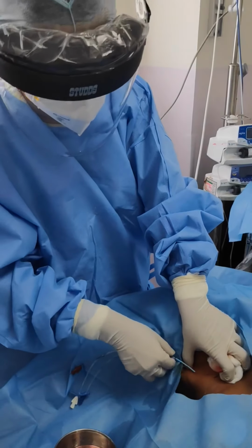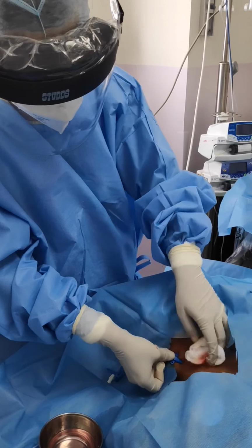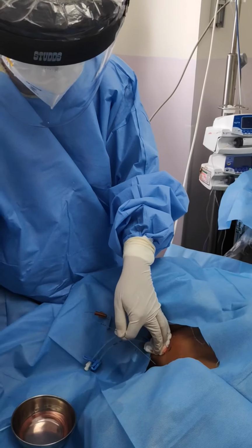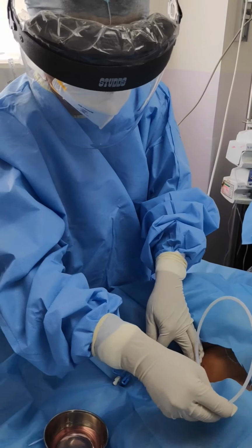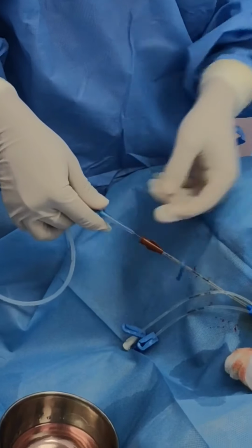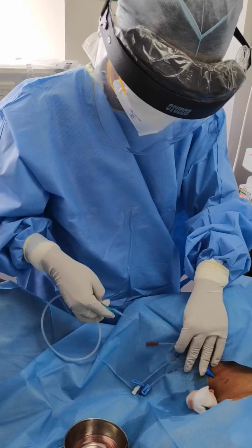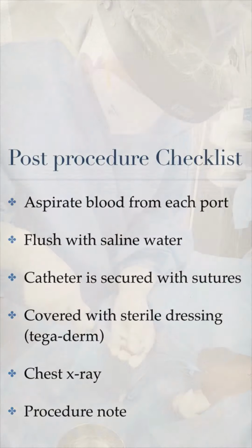The line is going smoothly without any obstacle. Now that the line is in, it's time to take the guide wire out. With all that done, now I'll be flushing each port with normal saline.